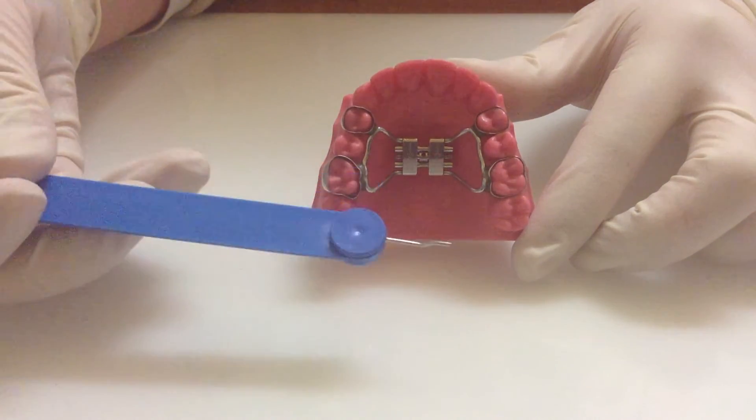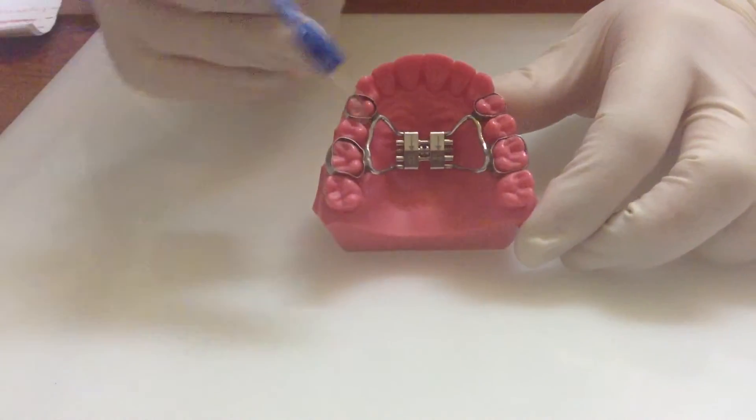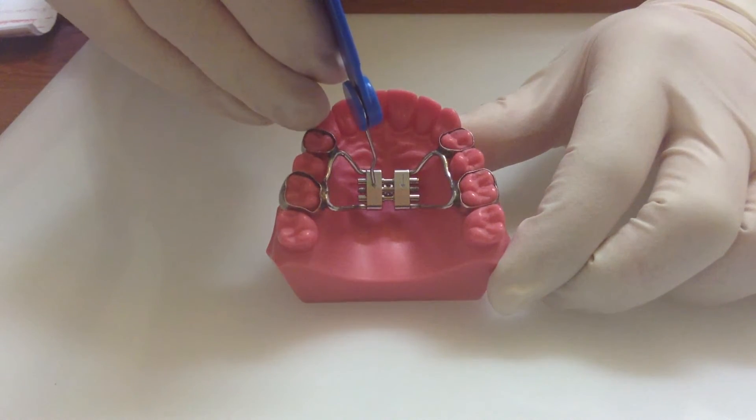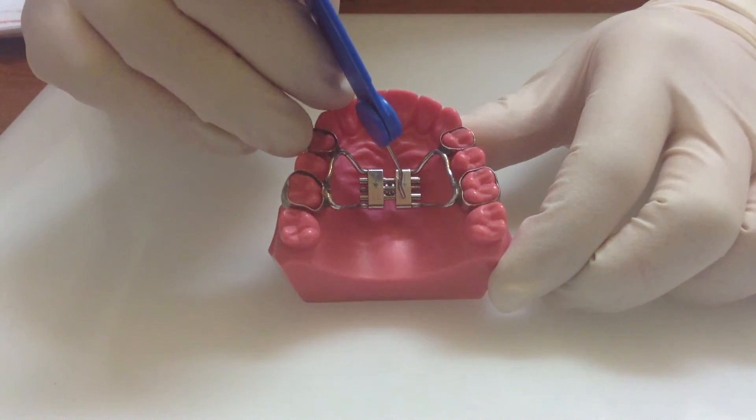This is an expansion key — you'll be given one of these. This is how you expand the plate. You can see here there are arrows, and this is the direction that you're going to be expanding the plate in, so always follow the direction of the arrows.